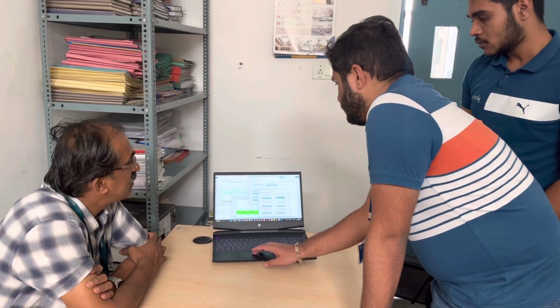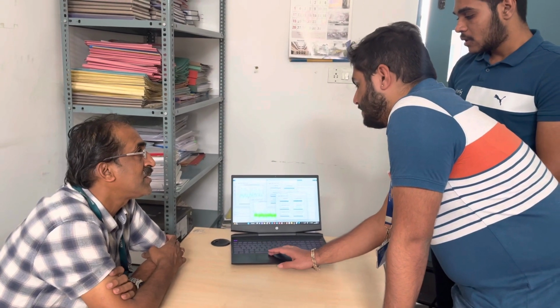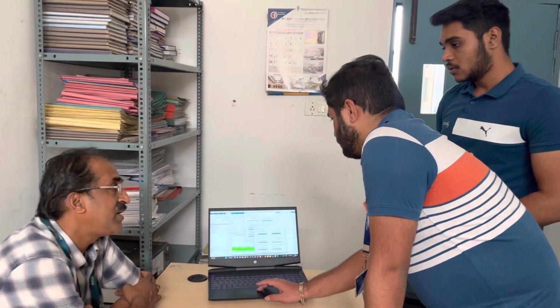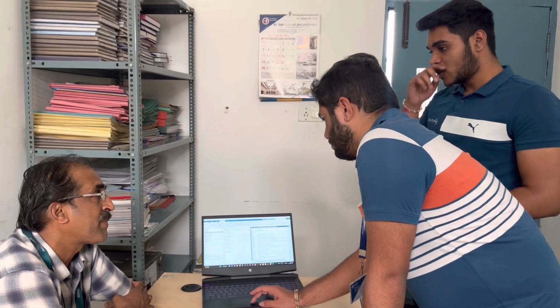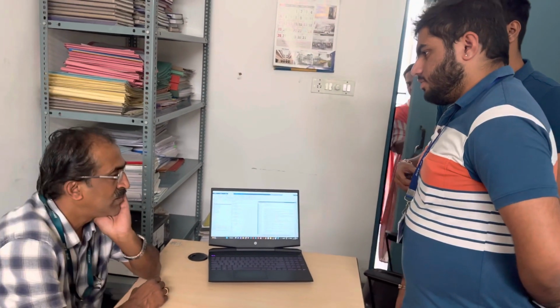In what way are these plots useful for a doctor for further diagnosis planning? They can check the heart rate. That is usually calculated to get the heart rate. Are there any earlier existing methods? What doctors usually do is analog signal analysis, like live signal analysis. They are not converting into digital samples.